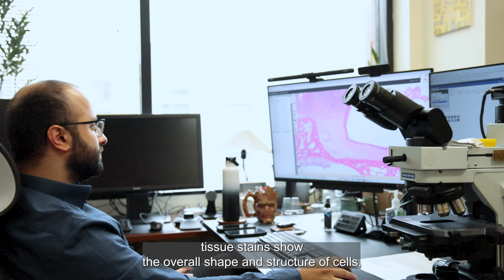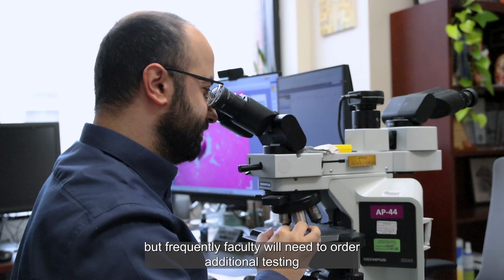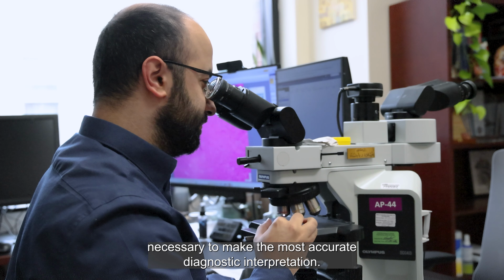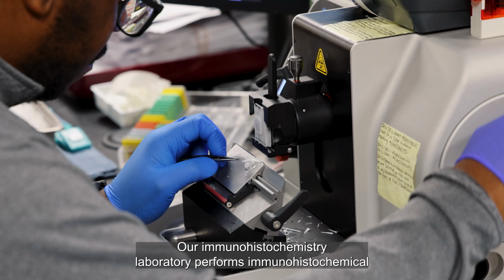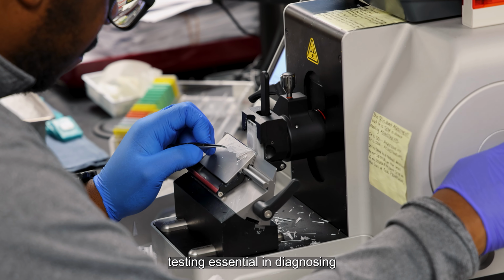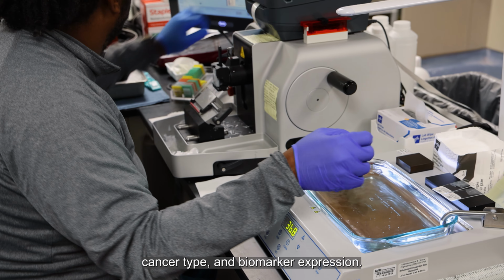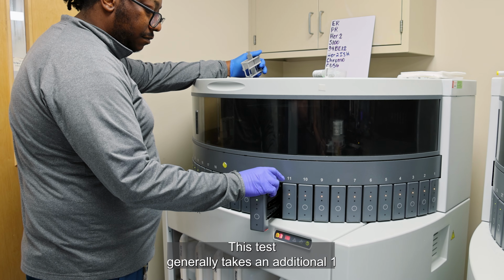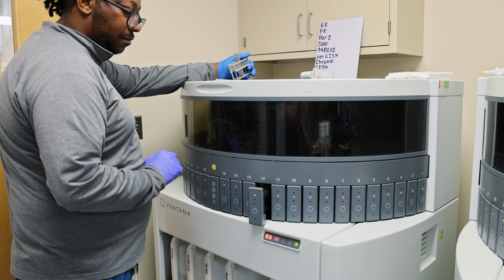Standard H&E tissue stains show the overall shape and structure of cells, but frequently faculty will need to order additional testing necessary to make the most accurate diagnostic interpretation. Our immunohistochemistry laboratory performs immunohistochemical testing essential in diagnosing cancer type and biomarker expression. These tests generally take an additional 1 to 2 days to complete, depending on the volume.